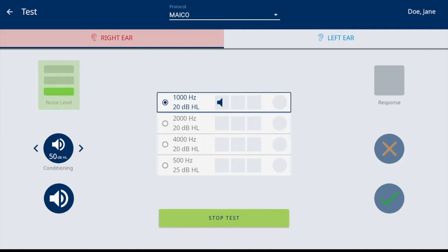The noise level is monitoring the room noise and displays results captured, the red bar displaying when any one frequency is outside the acceptable levels. The screening can continue regardless of the noise level, but allows the screener to monitor the room environment and halt the screening or attempt to quiet room activity. The room noise is based on the standard selected in the settings.